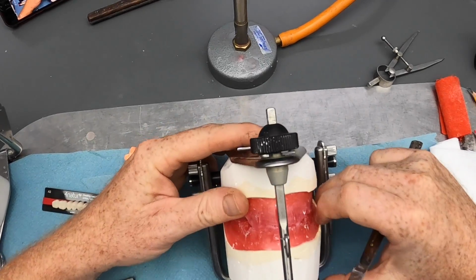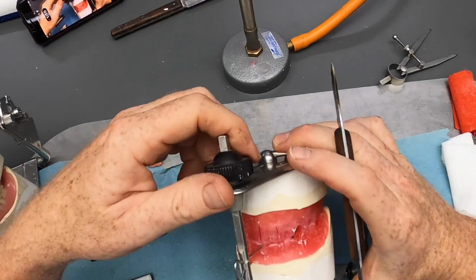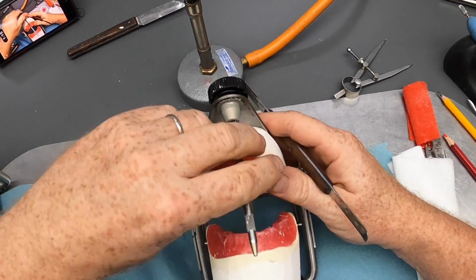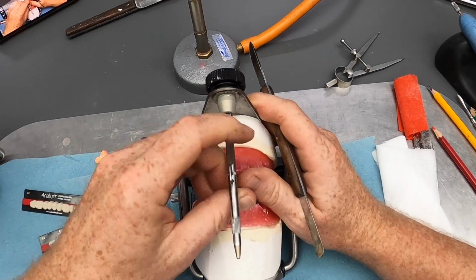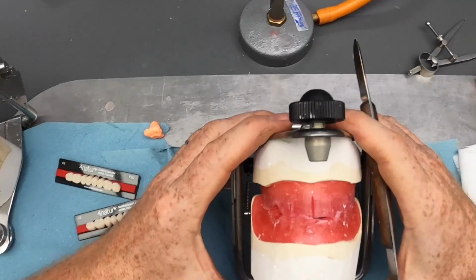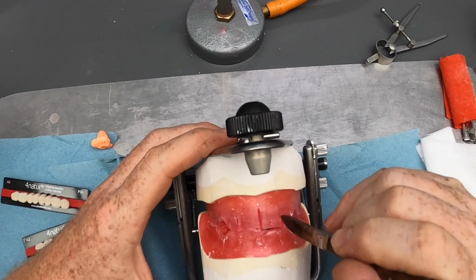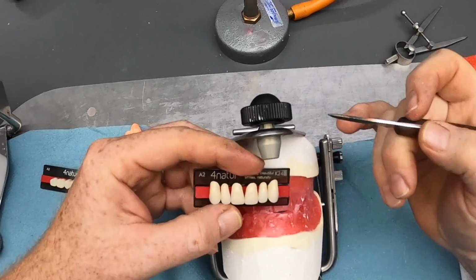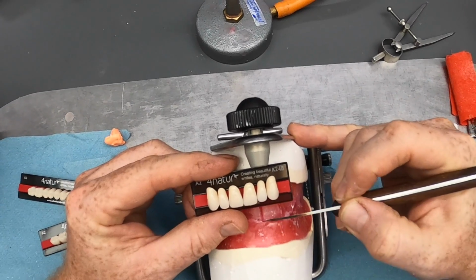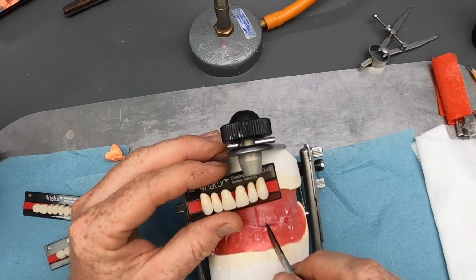at the occlusal plane. So when we're setting the teeth, then we're aiming to achieve several things. I'm just going to take the incisal pin out for the time being, just to make it clearer for you to see. You're best really to leave it in as much as possible, so you know you're not changing the vertical dimension. But it's worth just pointing out a few things. Obviously we're going to start here at the midline and work round. We're going to set our teeth such that the labial surface is flush here and the incisal edge is flush here. The central incisor is going to go nice and vertical, so the long axis of the tooth is vertical.